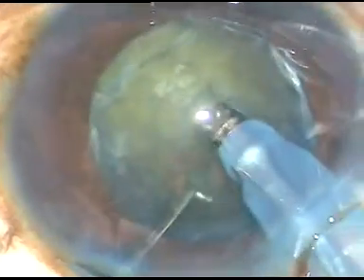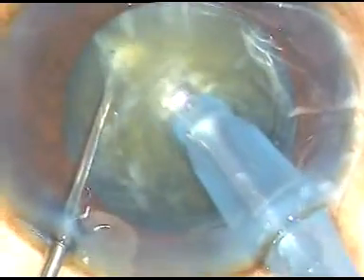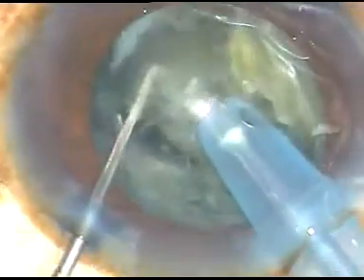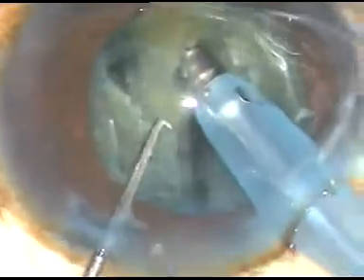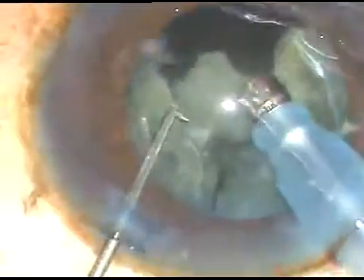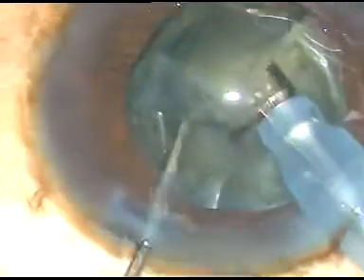Here it is. I go bevel down, then make the bevel up, and now I start sculpting. I go to a certain depth, I hold firmly the nucleus and I do the chopping. When the pupil is not dilated well, I do vertical chop because I don't want to go behind the iris. I don't want to do some activity in some place where I cannot see.